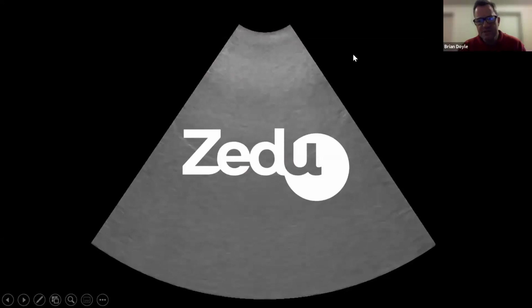Suean, I thought that was fantastic. Thanks a lot for going through that. The last bit we were talking about looking for pancreatic head tumors. I have to admit, I'm not sure I'm going to, in my career, be quite that clever. I think I'm going to see intrahepatic and common bile duct dilatation in a patient who's got painless jaundice and just go, okay, it probably is, and get somebody else to do the study or get an MRI or something. I don't know what you guys think. Yeah, that's fair enough.